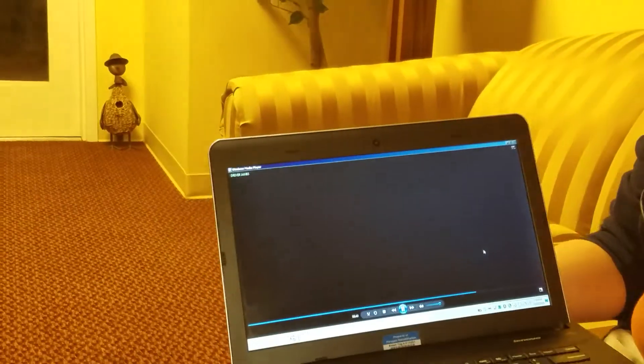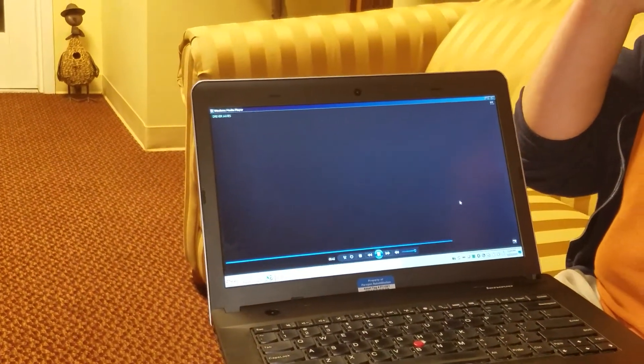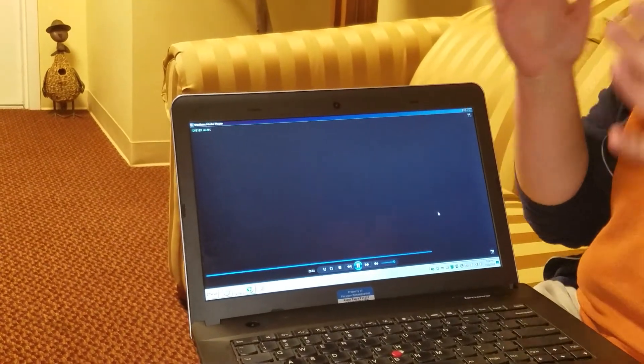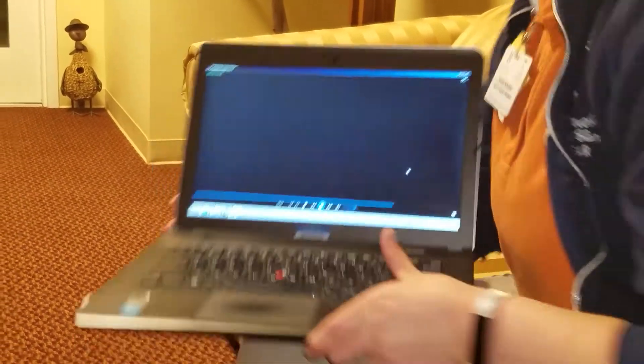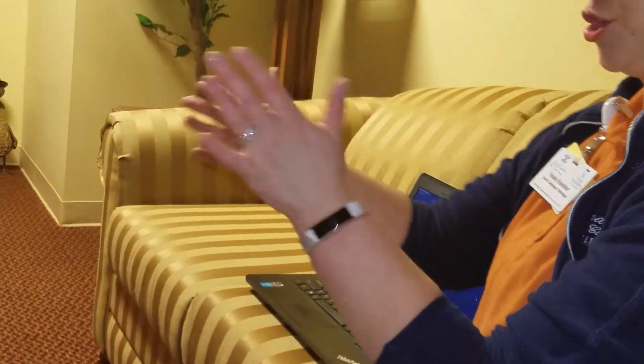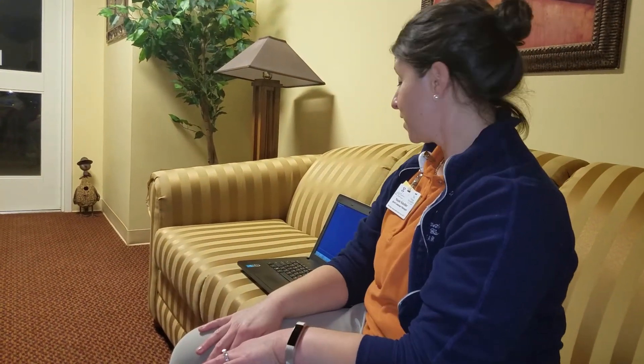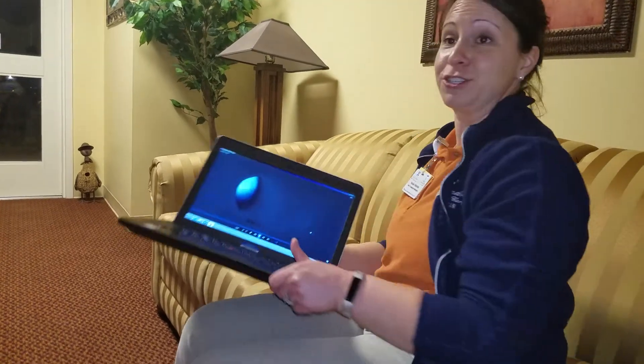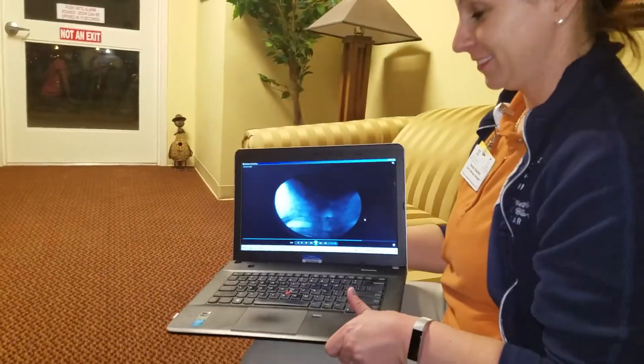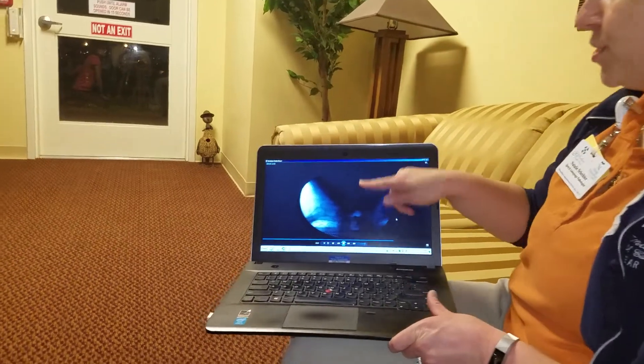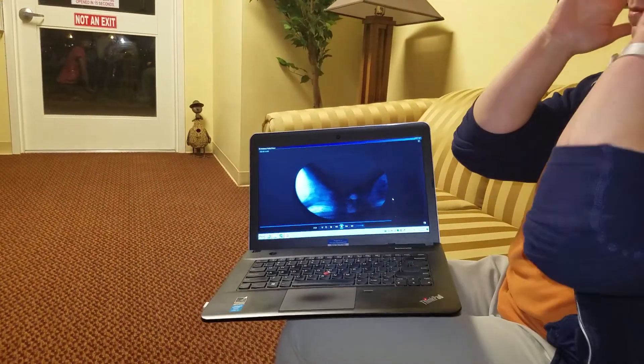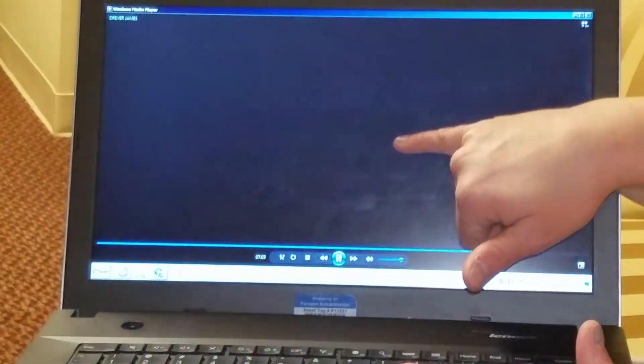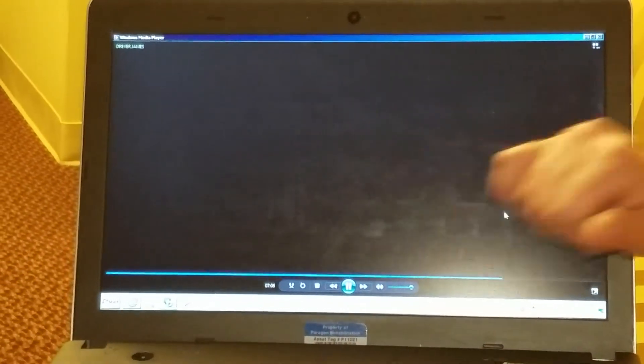Okay, so now we turn him. First views were sideways, next views we turn him so we can watch the food go all the way down the esophagus to make sure it's all going down. So now that's going down his throat? Yeah, so now he's midline. You can see this is like his back.